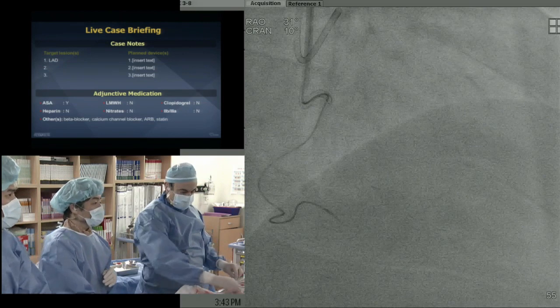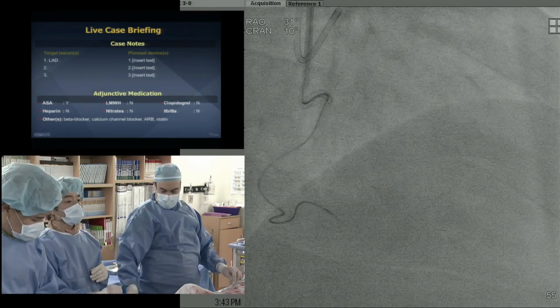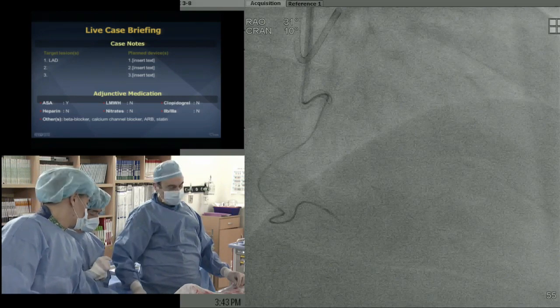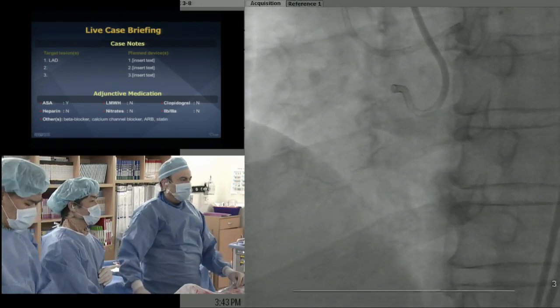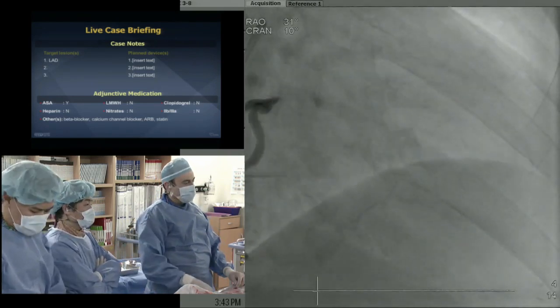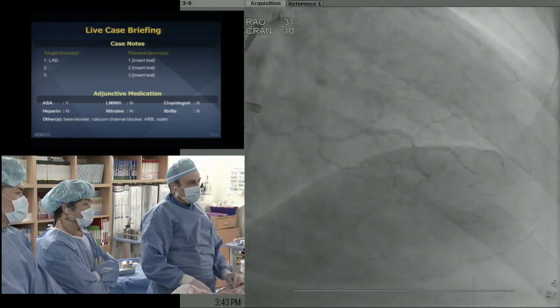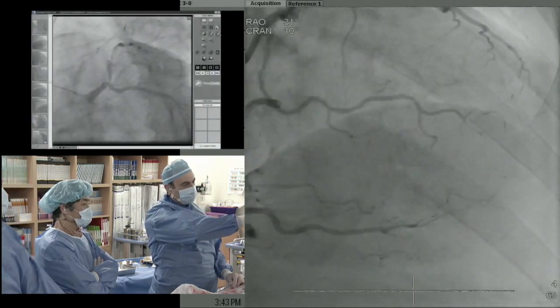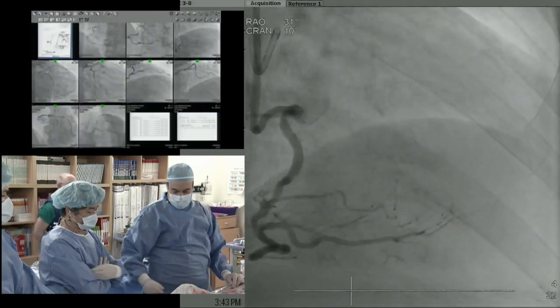Yes, we're ready for the angiograms. We can show you the angiograms from today. Can you see them? This is an RAO cranial shot. There's not too much contrast going there, so we just repeated it. Actually there are some septals that appear relatively promising. Particularly there's a second branch of the PDA at the bend, where after a little bit of tortuosity it may be connecting up to the LAD.